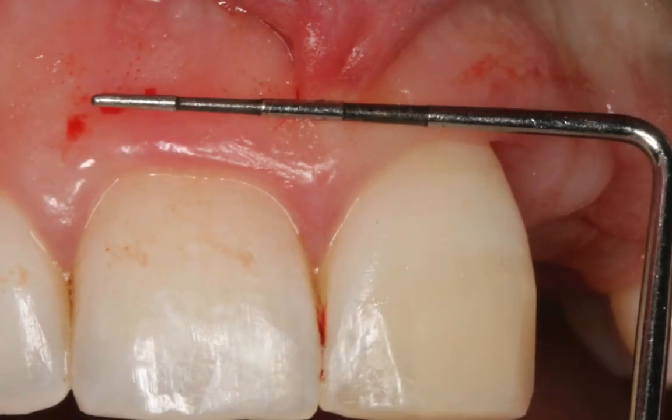In this video I'm going to show you the actual surgery and parts of it. I'll show you some of the challenges, and I'll also show you how we combined a frenectomy and how important it is. Okay, so if you're planning to perform an aesthetic crown lengthening, you want to evaluate the site quite well. You have to have a really good plan in terms of where you want your ideal gingival margin to be.